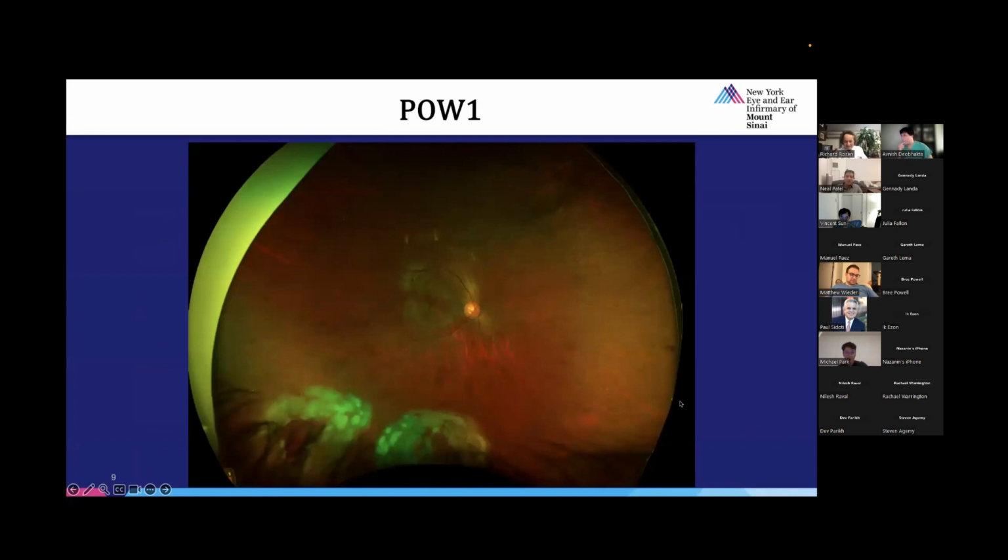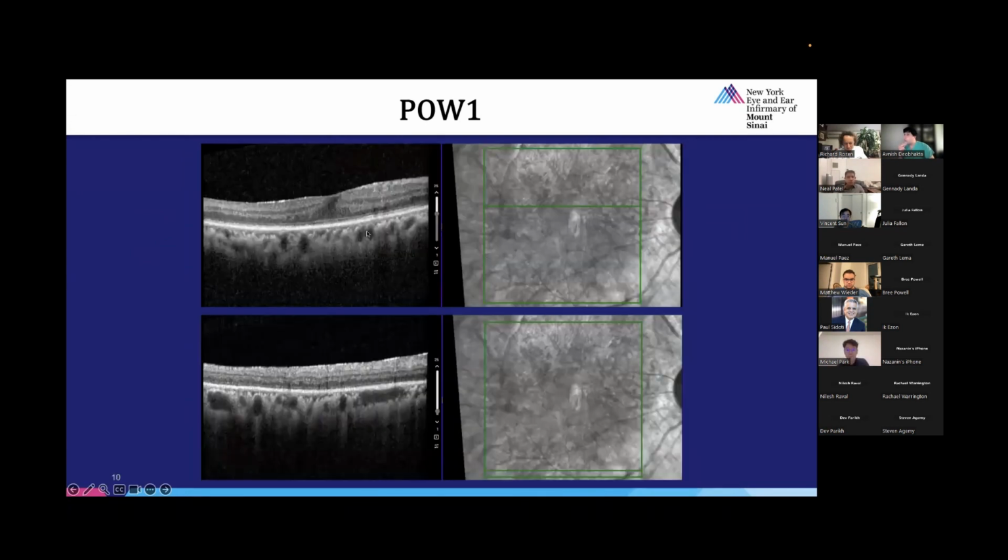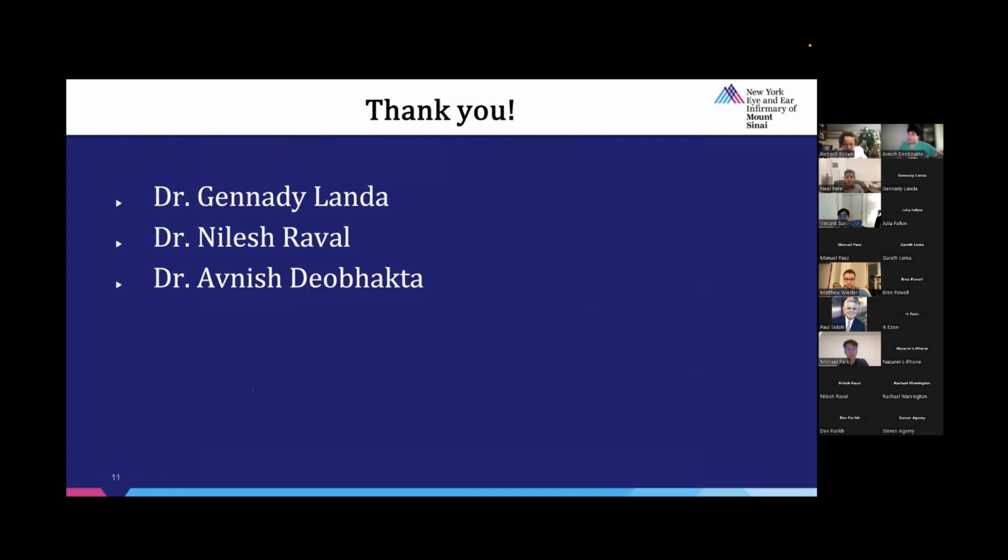All right. So she shows up post-op day 1, the anterior lens was clear by that point already, and she had a small air bubble in the eye. By post-op week 1, the air bubble was gone and she was doing well. There's no oil in the AC, visual acuity pinhole to 20/100. We see our inferior breaks with some good laser and well supported by the buckle. We have an OCT confirming that the retina was flat, both centrally and at least as far inferiorly as this OCT would go. She does still have this ERM with some distortion of the foveal contour, but all said, doing well. And that's all I have.